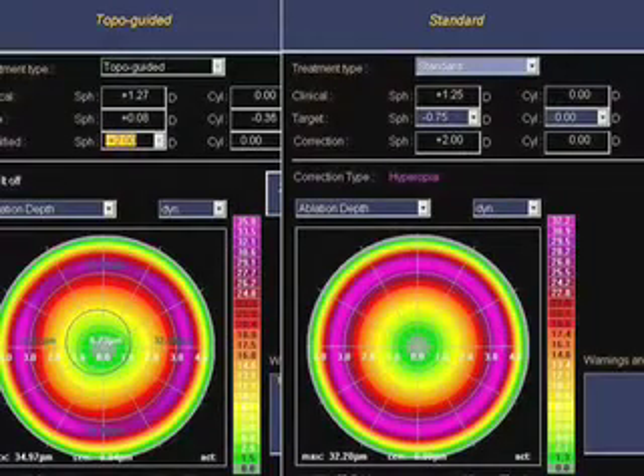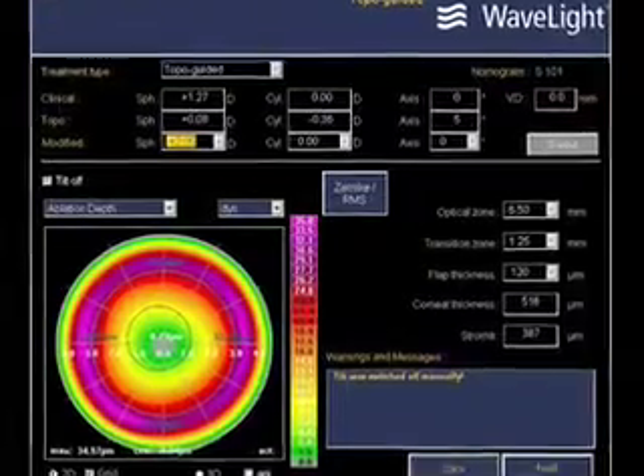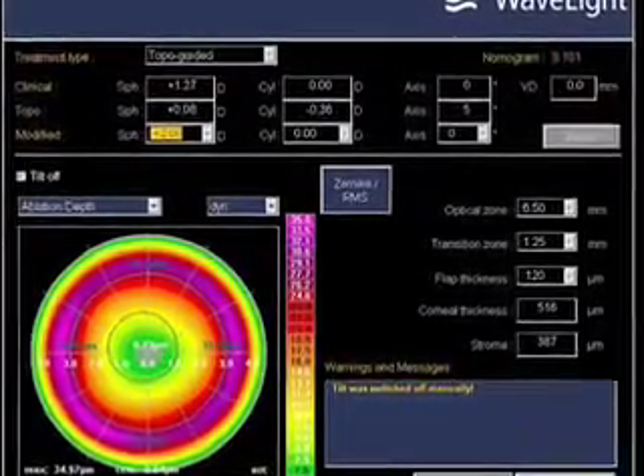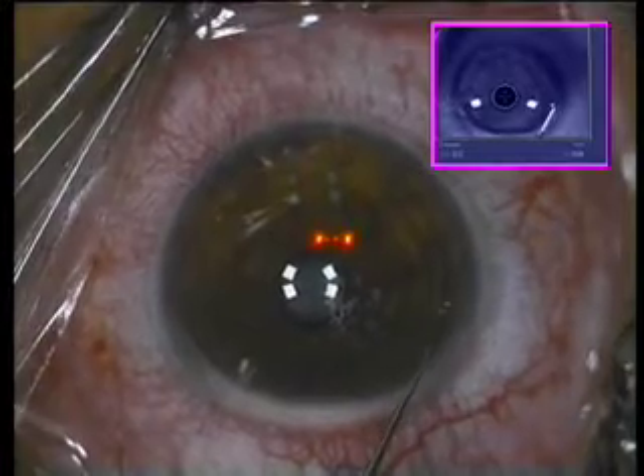The applanation disc is removed. Here we're seeing the two plans for correction: on your left, topography-guided, and on your right, standard. We chose topography-guided in this eye. You can see that the treatment is de-centered compared to the pupillary center, but centered onto the line of sight.